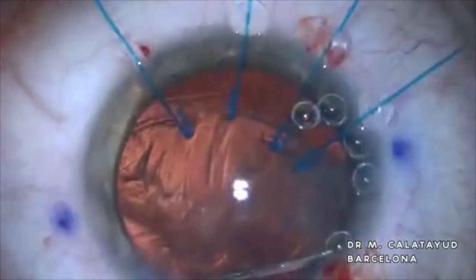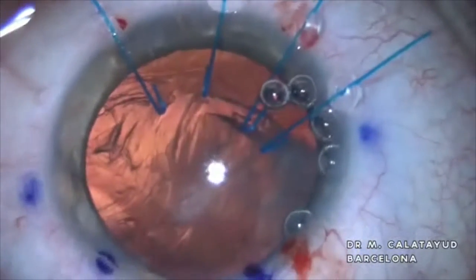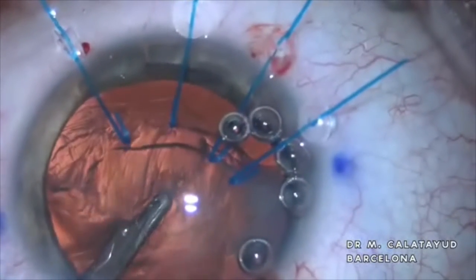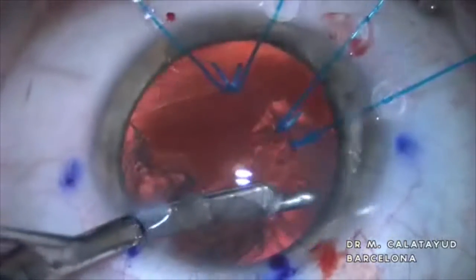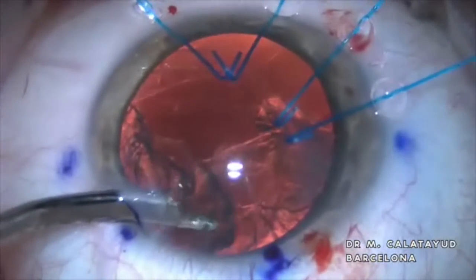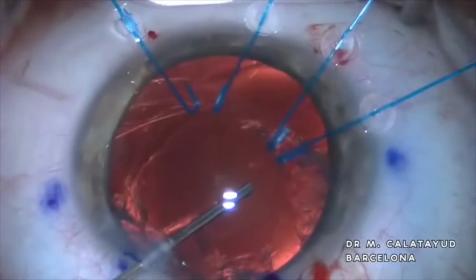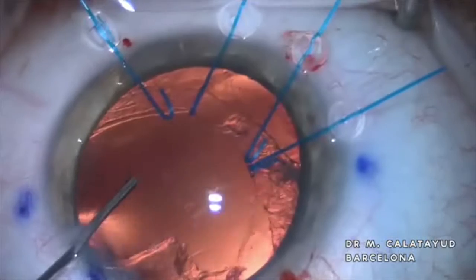If the cataract is not too hard, we prefer to hydrate it with BSS and then gently aspirate the crystalline material with a 5E cannula. We do not like to use the irrigation-aspiration tip of the phaco, as sudden changes in the intraocular pressure can cause a vitreous prolapse and complicate our, for the moment, uneventful surgery.